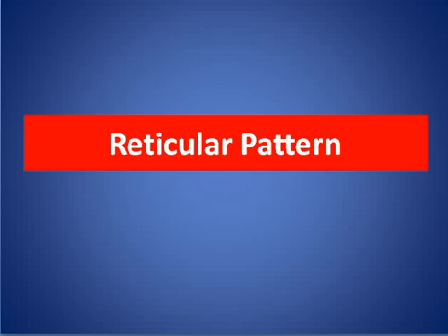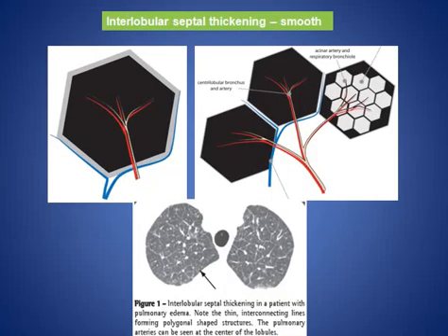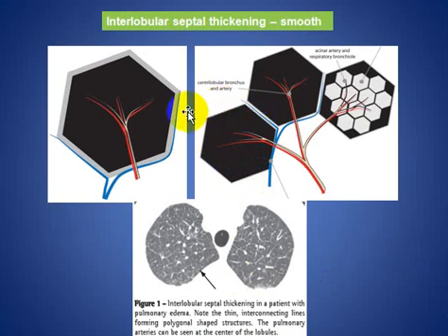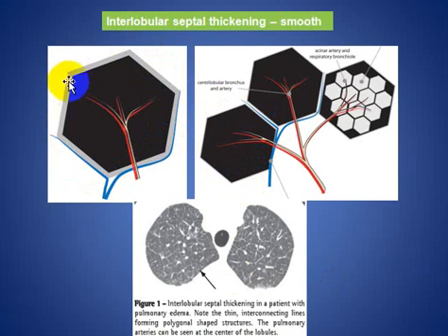Here I will discuss in this mini talk about the reticular pattern involving the secondary pulmonary lobule. As we see here, this is the normal septum, and here you see there is some thickening of the normal septum, and you can see the thickening is smooth.